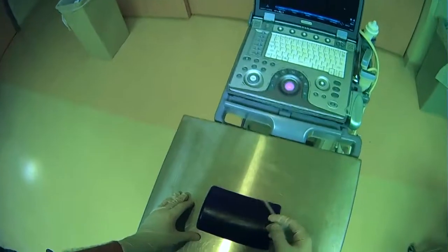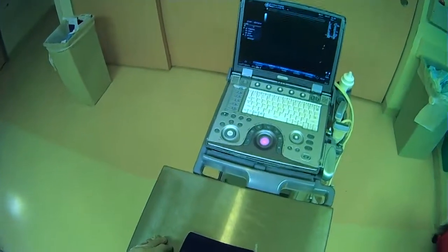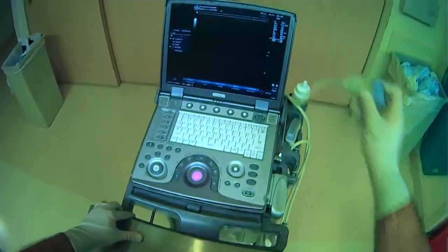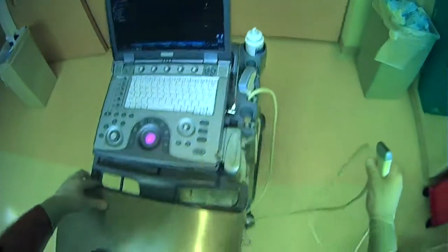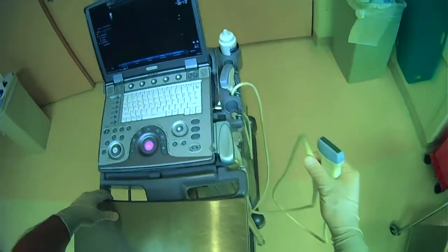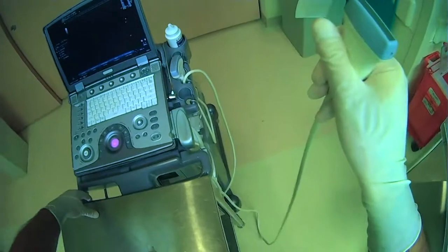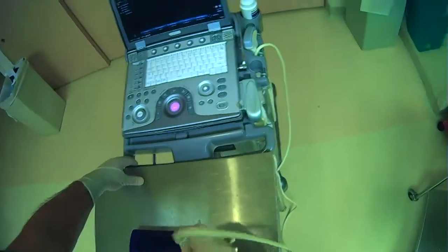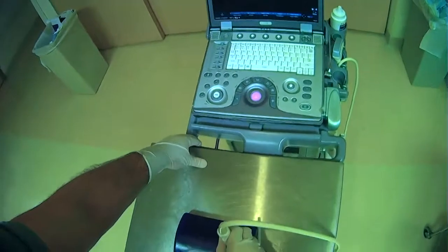Not only is it nice to have the machine in front of you, but you also want to keep in mind where your probe is going to be and where the cord of the probe is going to be. We're going to be using this flat linear probe, which has a lot of cord that will fall down. This cord has weight — it may not seem like a big deal, but if you're trying to hold your ultrasound probe and the weight of the cord is dragging you down, this over time can become a nuisance.